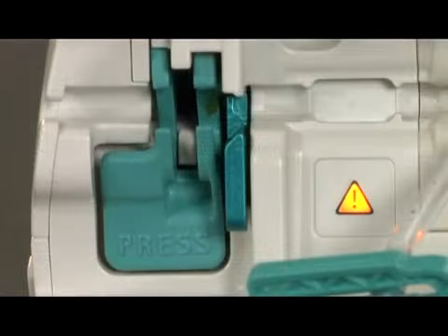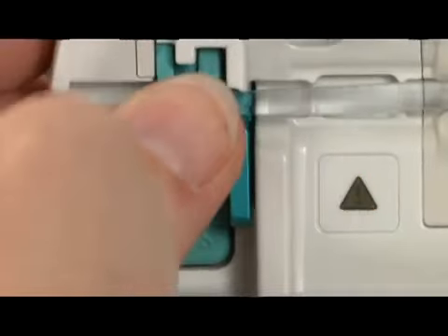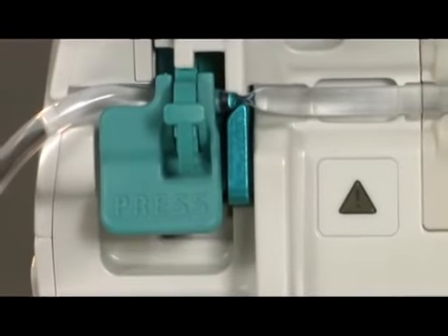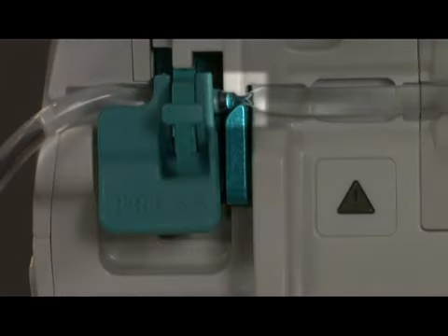Next, take the green free-flow protection clip, which provides the set-based protection, and with the hook facing down and toward you, insert it into the green slot on the left side of the pump. You will see three actions. The pump-based free-flow protection lever moves up and locks into place securing the IV set. Note the tubing is behind the lever. The safety clamp pinches the set. Depending upon the serial number of the pump, the safety clamp will be green or silver.